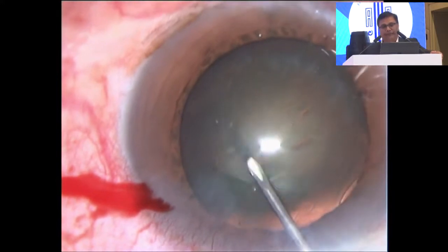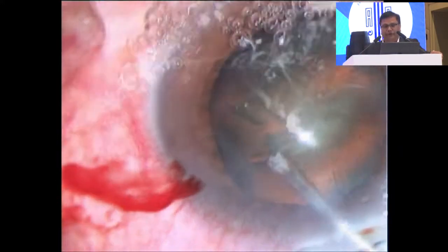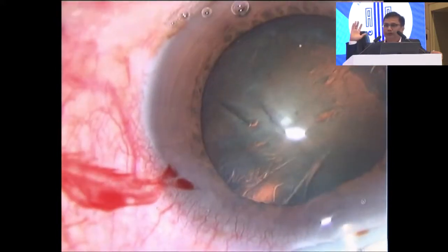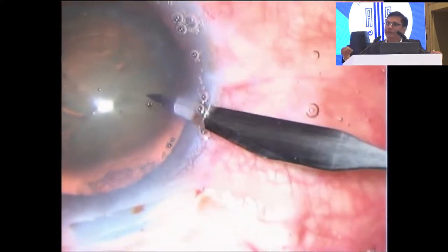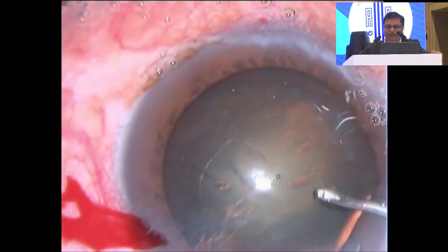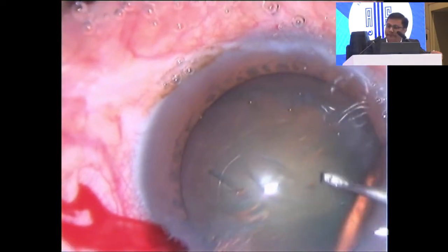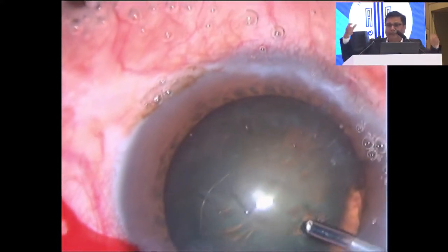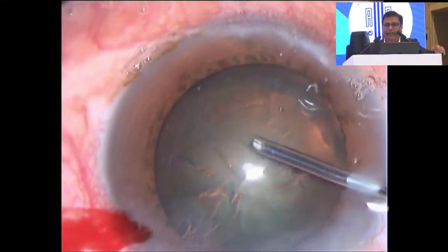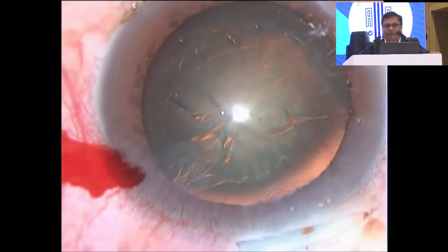Sometimes, now here you can see, suddenly my assistant pushed the water and the patient moved and the capsulorhexis ran away. It's a very simple situation, but the capsulorhexis ran away, how to proceed? You can take the nick at another place. In the last slide we saw, of the madam, that it was just a rhexis run away. And how to proceed? So take it at the other side and you can proceed.